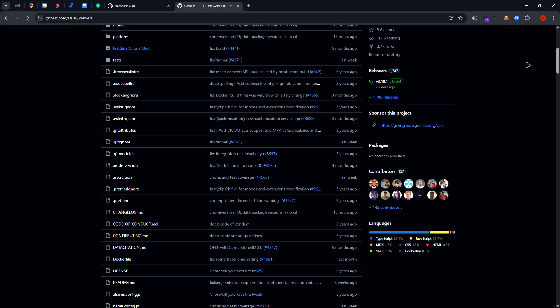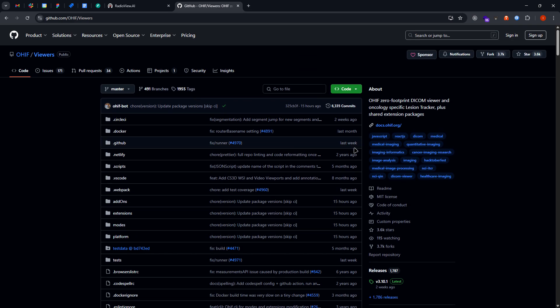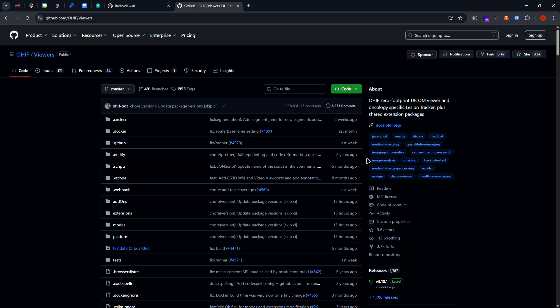Hello everyone, so in this video I'm going to show you how we have managed to implement the OHIF viewer, OHIF DICOM viewer inside of our custom web application.